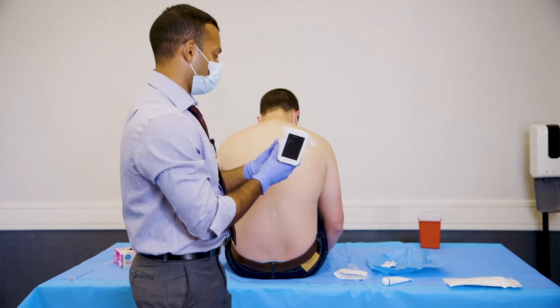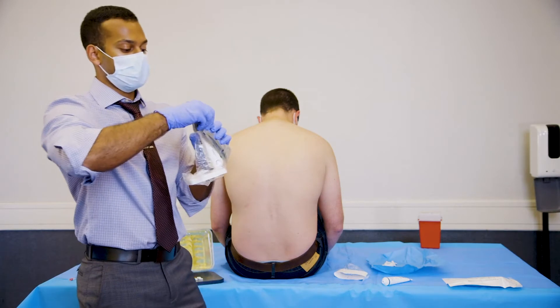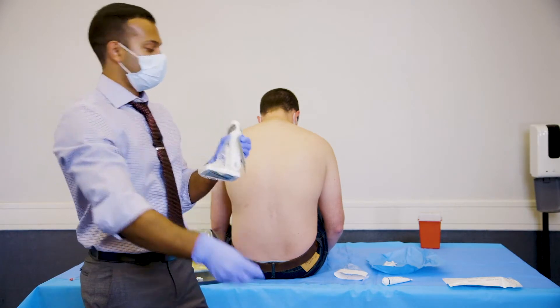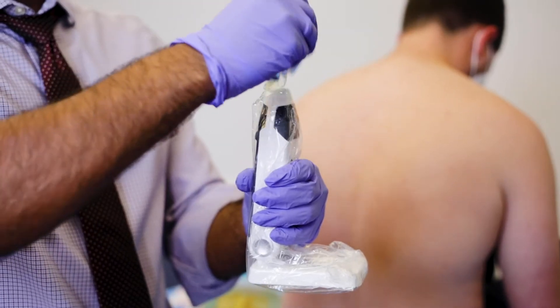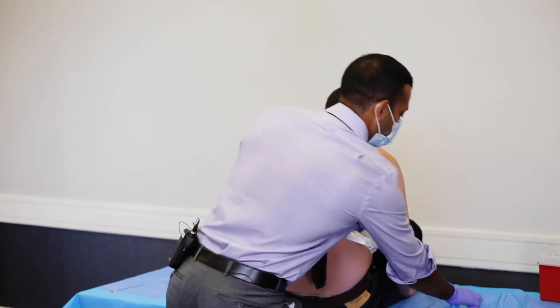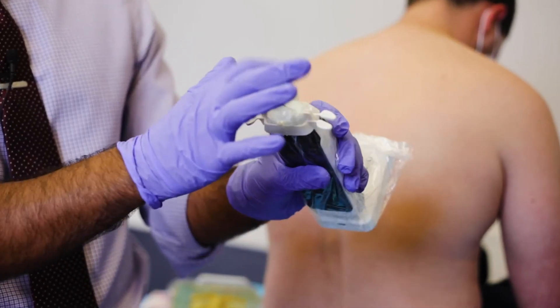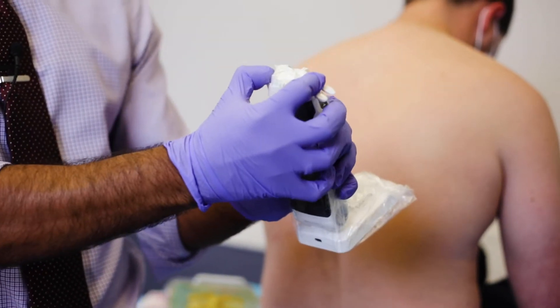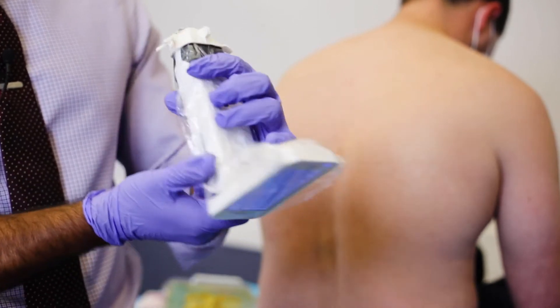After that you're going to put your gel on this. Take your sterile gel, open it up, and place it on the probe. Then place your locator needle guide, which is also in the pack — the long end is going to be facing upwards. Push down firmly and you're going to feel it click into place. After that you're set up to start scanning.